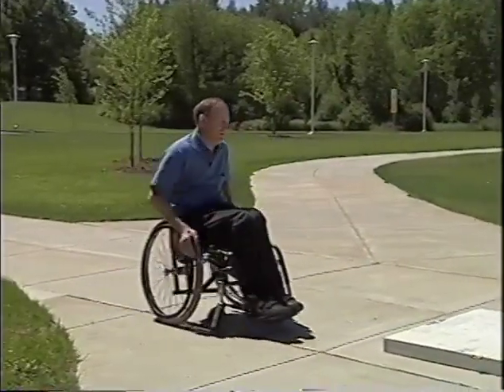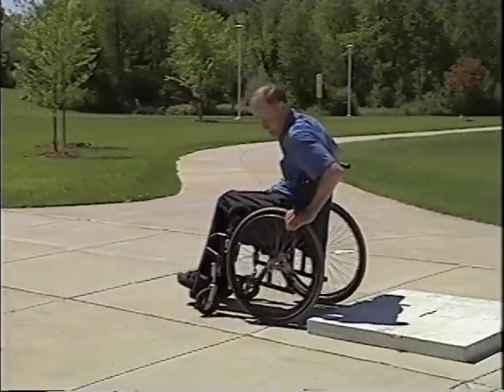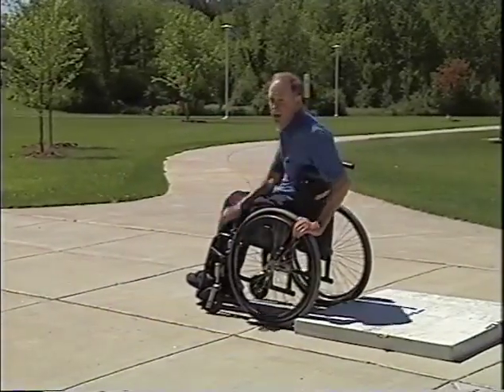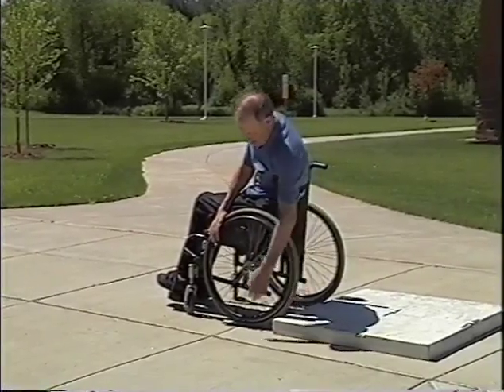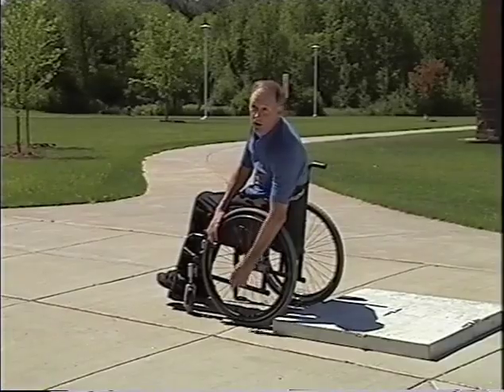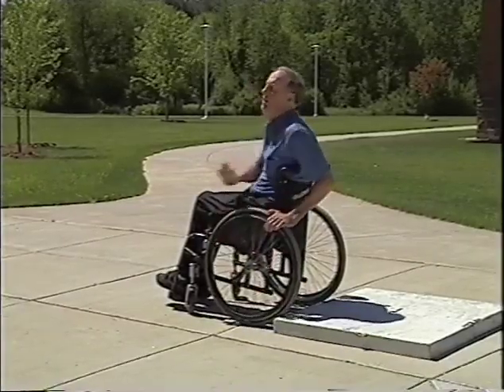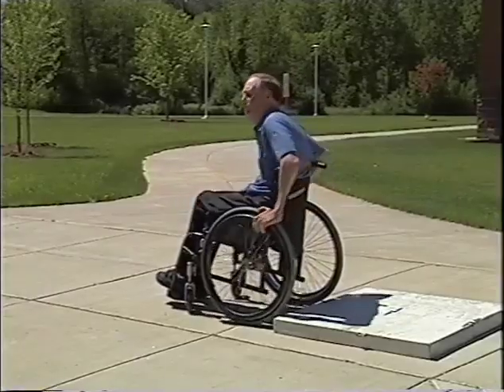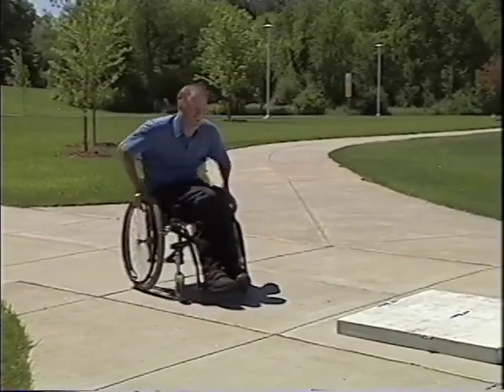Now the reason for this is when you land on the ground, the bottom of your tire, which was here when you started, has now been pushed 8 inches forward in just this 2.5-inch drop. So it gives you quite a push behind you. And what you'll find is when you do that, the chair is pushed out from underneath you.